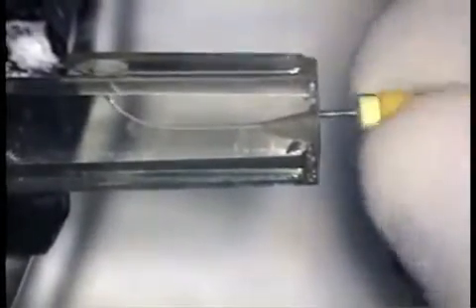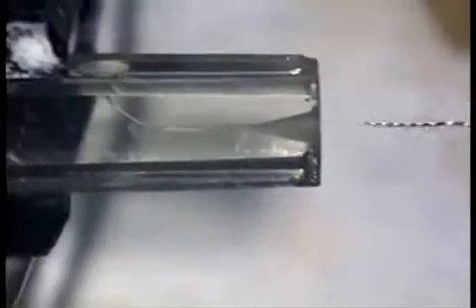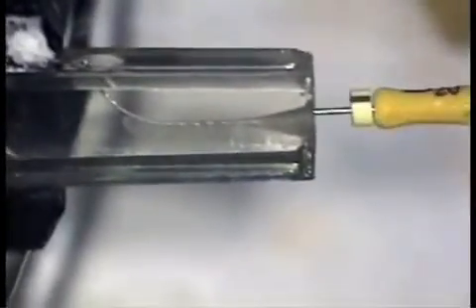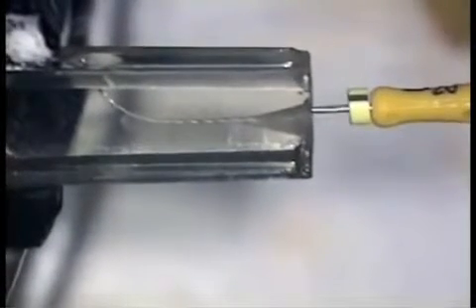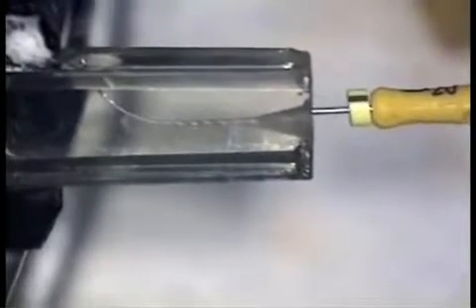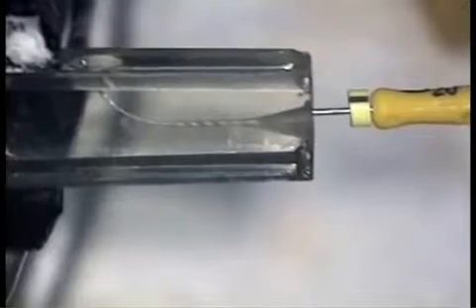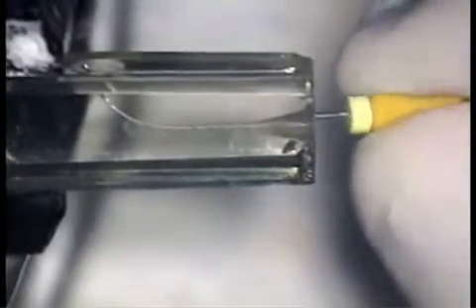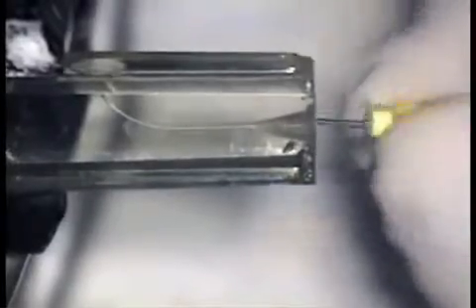The number 20 relieved reamer encounters more torsional and apical resistance. This resistance never decreases to the point where 360-degree arcing can occur. As a result, shorter strokes are used throughout the shaping when using the number 20 relieved reamer in this canal. Please note we are still attaining our full apical length. It is just being attained with shorter horizontal strokes.